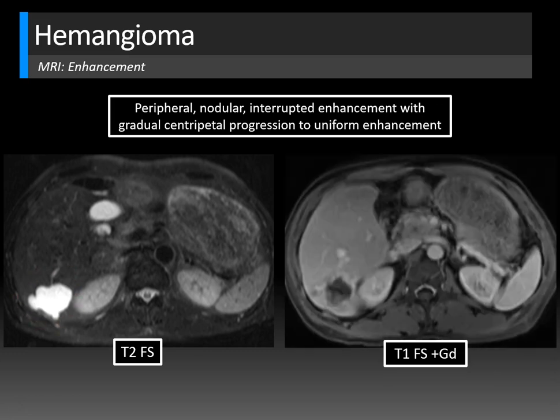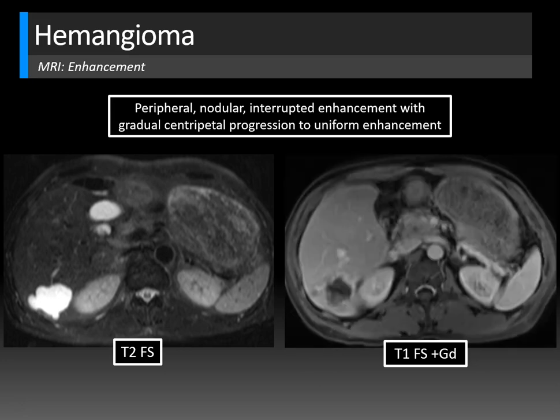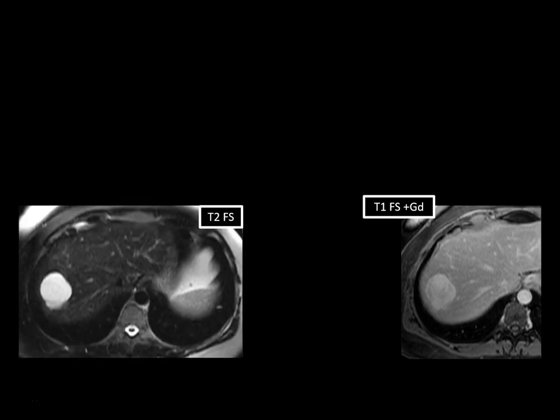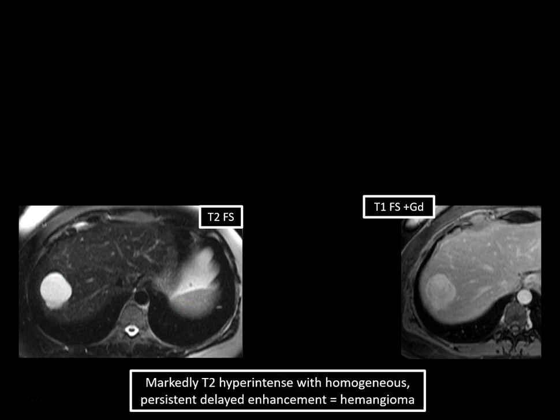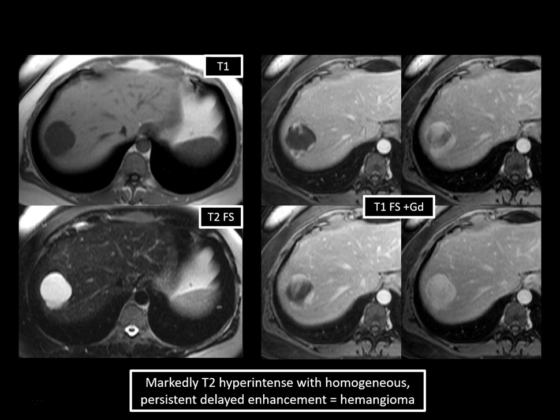Here's another example showing markedly T2 hyperintense hemangioma relative to the spleen, demonstrating gradual centripetal peripheral nodular interrupted enhancement — a puddling that continues to fill in. On the delayed phase MRI at five-minute delay, a homogeneously enhancing mass in the right lobe is visible. Combining markedly T2 hyperintense with persistent delayed enhancement is very likely a hemangioma. The T1 image confirms hypointensity isointense to the blood pool, and earlier phases show peripheral nodular enhancement with gradual centripetal progression.